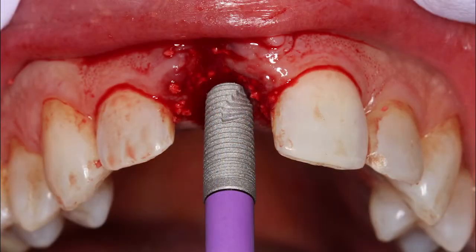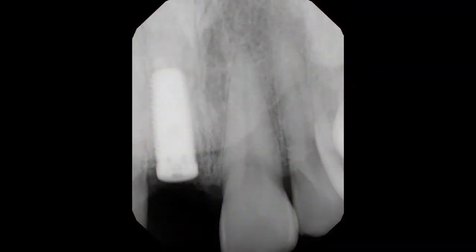In Figure 7, we see that a 4.7 millimeter by 13 millimeter inclusive tapered implant from Glidewell Direct was threaded into the prepared socket site. In Figure 8, the digital radiograph of the implant shows the ideal position at the crest of the edentulous ridge.